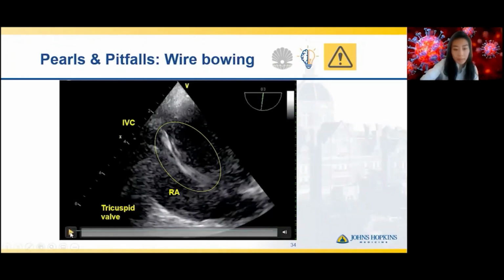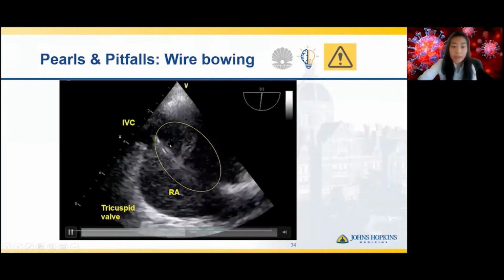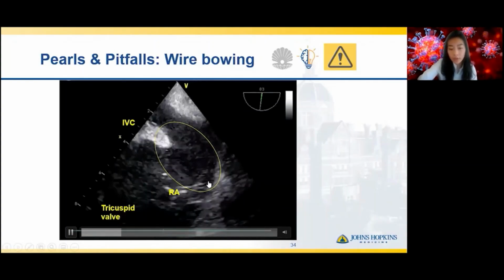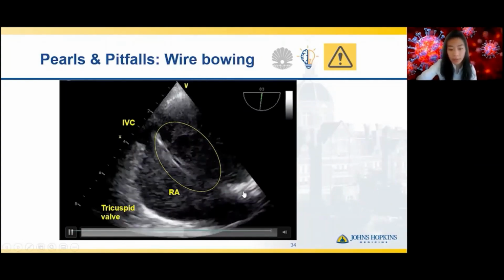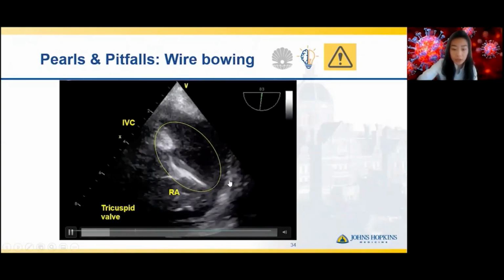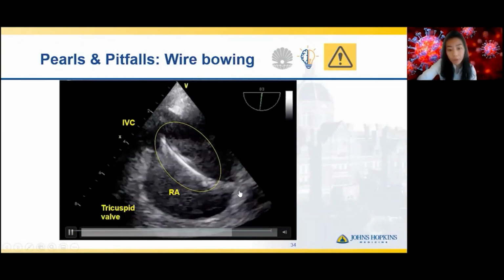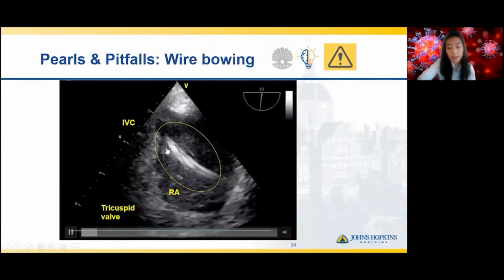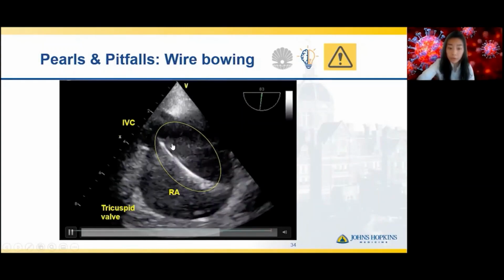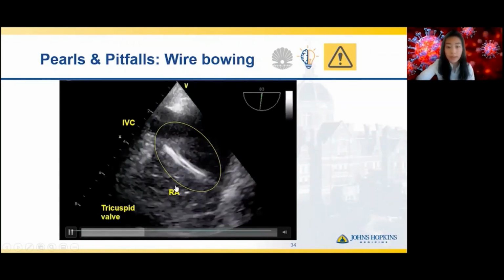So again, in monitoring wire placement during the steps outlined, we do want to make sure that the wire not only ends in the right position in the hepatic IVC, but that it doesn't undergo any deformation or bending as the dilators or cannula are being applied. Sometimes we do see in this example, with the shear stress of the dilators themselves, although we can't see the dilators, we can see an applied force in this characteristic bowing or bending of the guide wire within the right atrium. Now, this is probably okay, but it is certainly vulnerable to being bent or to becoming out of position. And so again, you can see why continuous guidance is so important.